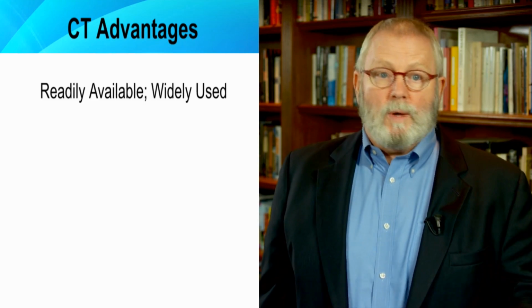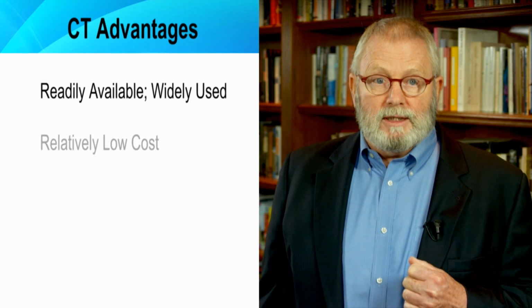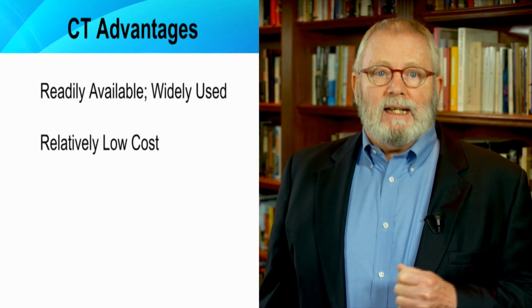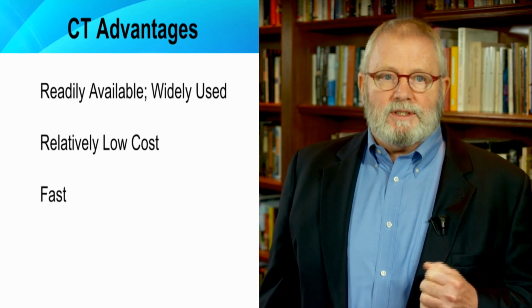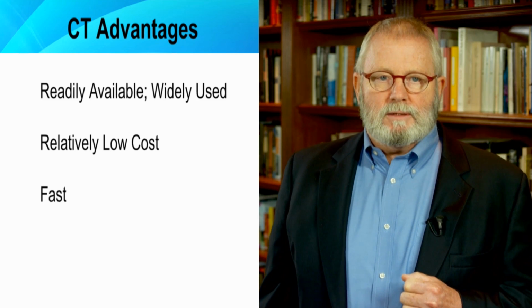Now let us review the relative advantages of MR and CT, and briefly review the circumstances in which each is most appropriate. The most common modality used to evaluate cochlear implant candidates and recipients is high-resolution, fine-cut temporal bone computed tomography. No contrast is necessary. Its advantages include its widespread availability and relatively low cost. CT scanning can be performed very quickly. Once an individual is within the scanner, acquisition of images takes only a few minutes.